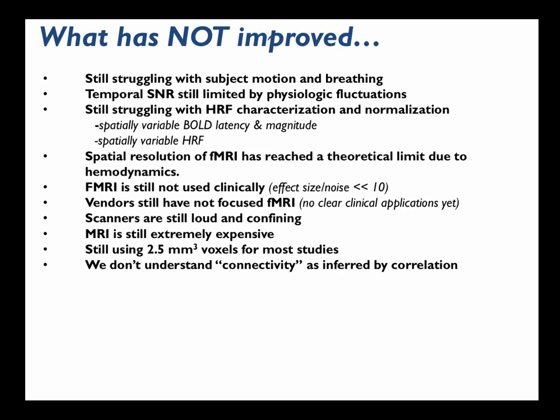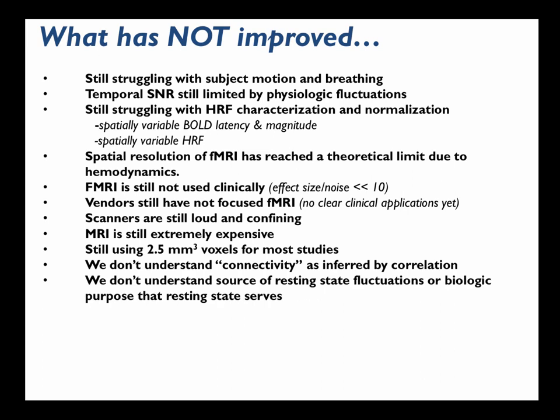You can change the amplitude of one, you can change the noise, you can change the latency. All that changes correlation, but it might have nothing to do with connectivity. So we really need to dig deeper in understanding the relationship between the correlation of our signal and connectivity. We don't understand the source of resting state fluctuations, and we don't know what biologic purpose it serves, or if it does serve a purpose.